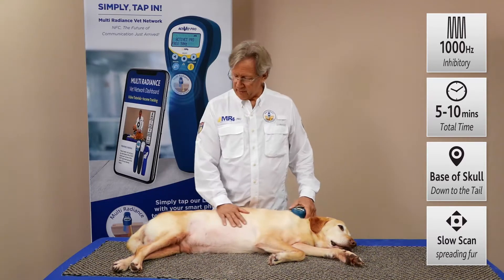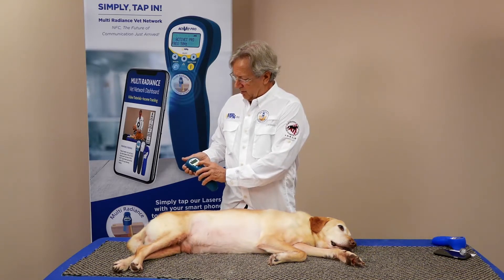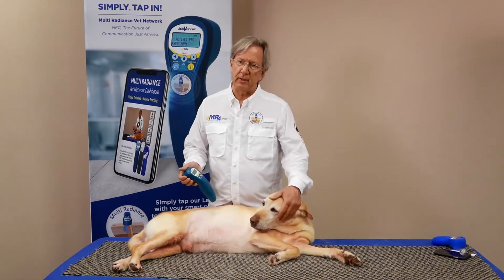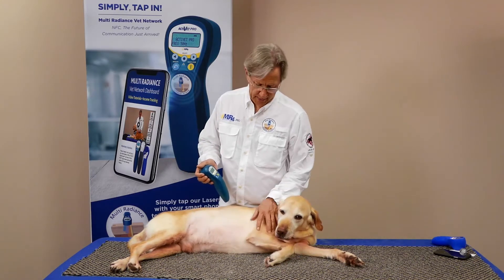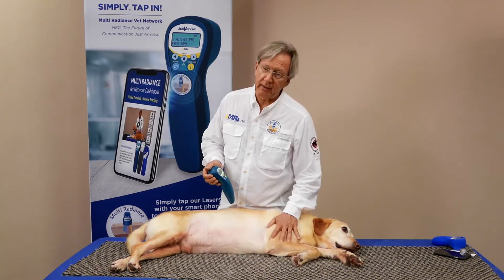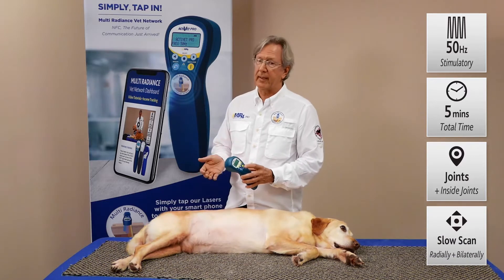As relaxed as he is, I think we can move on to the next phase of the protocol, which is to push stop, come back, and change up to 50 hertz. We've provided our inhibition and pain relief along the spine, and now we're going to use our stimulatory frequencies at the joints to improve blood flow and accelerate tissue repair by producing more ATP — adenosine triphosphate — which makes new healthy cells that proliferate where they're needed. At 50 hertz, press select, come up to five minutes, then push the power button and we're back in business.